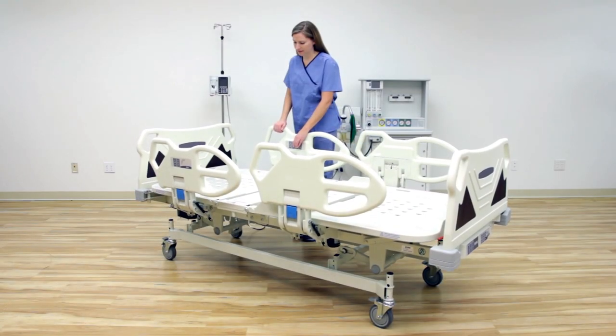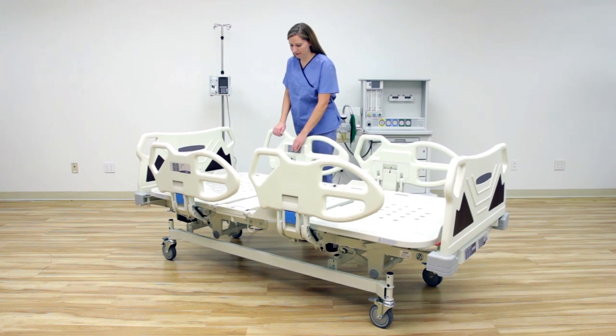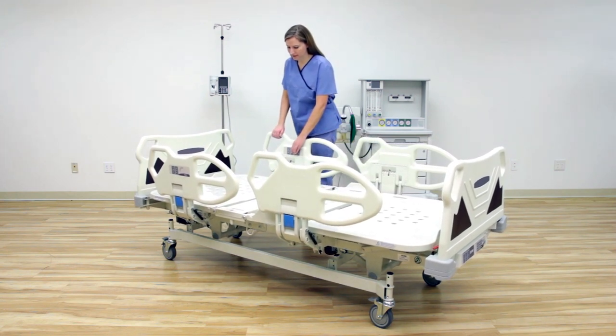Lowering the Premio to its minimum height of 19.5 inches allows patients with accessibility concerns to get safely in and out of the bed.